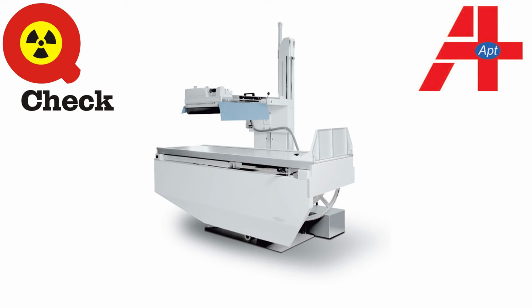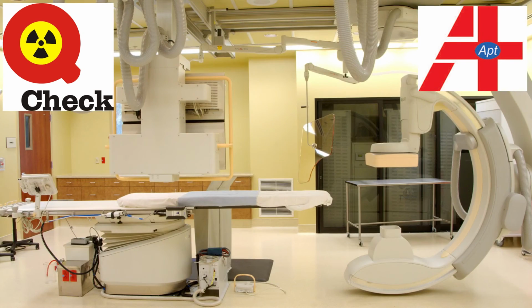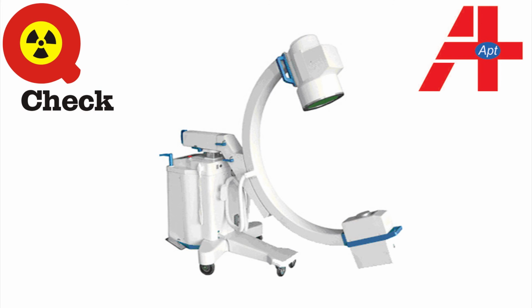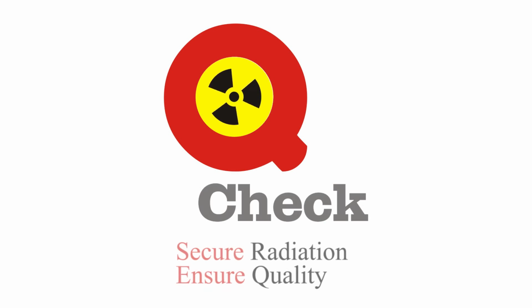Based on the measure correct measure principle, the QCheck methodology is the only effective methodology to keep X-ray machines, cath labs, mammography, CT scan and dental X-ray machines from deviating from the AERB standards. QCheck program will help you increase the life of your machine. QCheck means secure radiation that ensures quality.